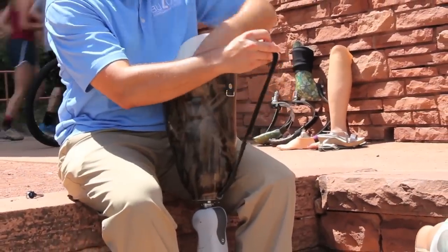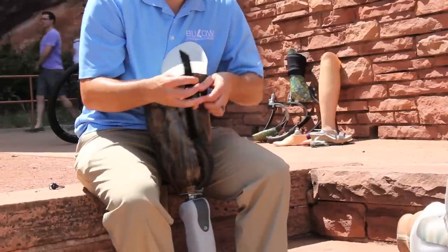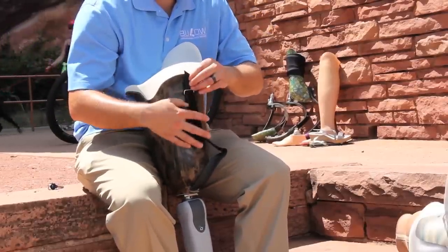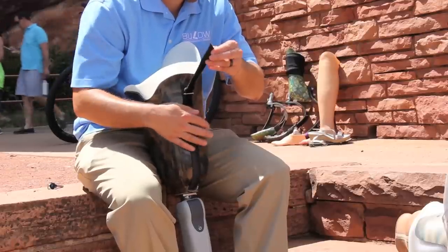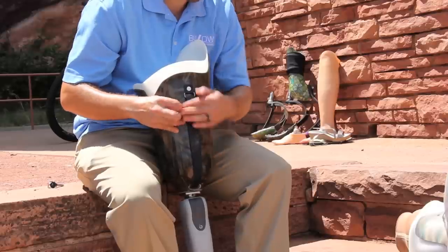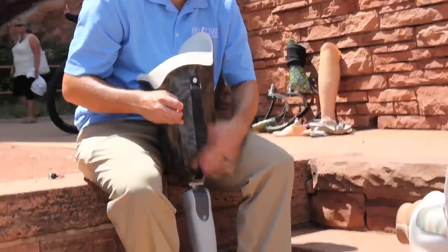The limb is placed in the liner, then into the prosthetic socket. The strap exits a hole in the socket, is fed through a buckle or chafe, and is secured back onto itself utilizing Velcro or other locking methods.